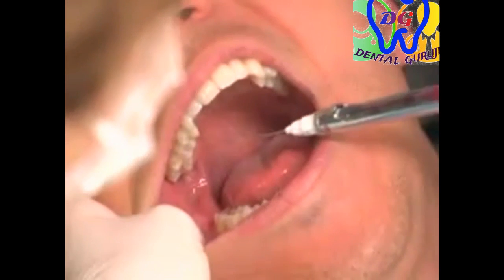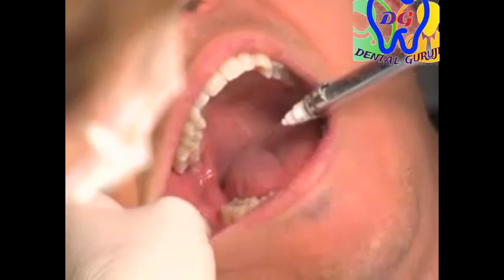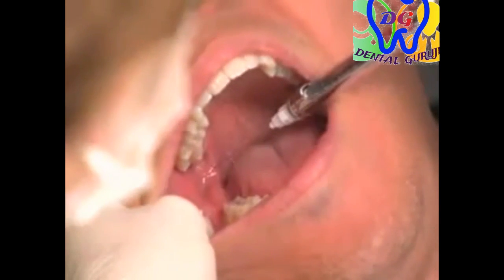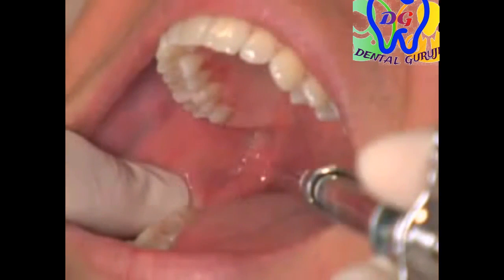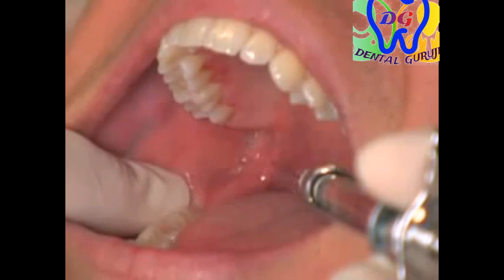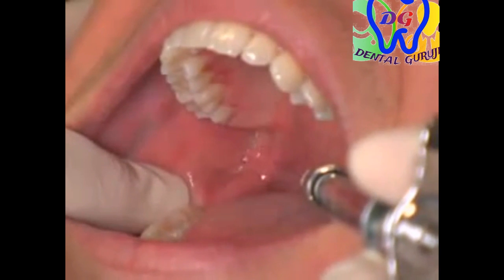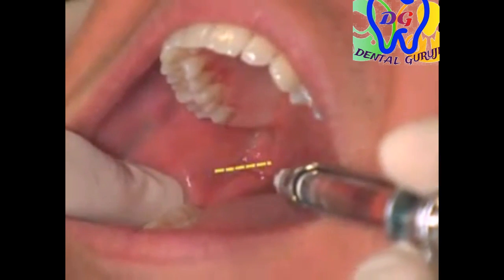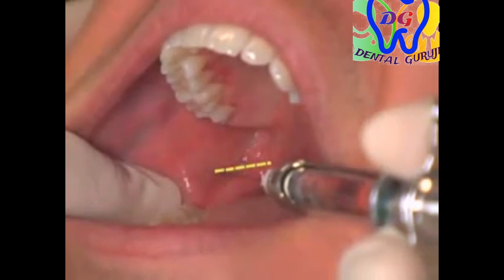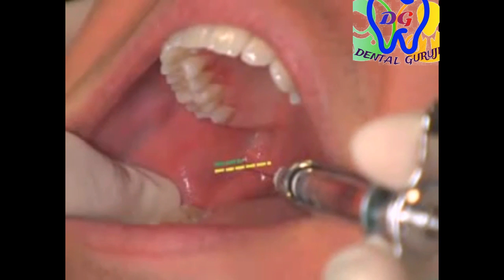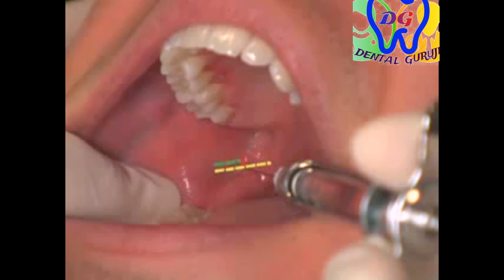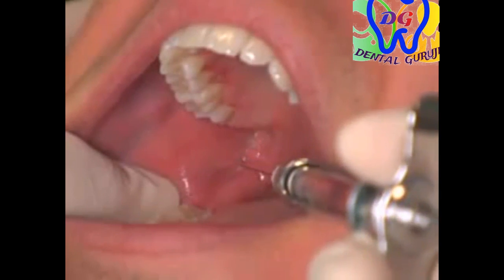The barrel of the syringe is placed in the corner of the mouth on the opposite side. The needle tip touches the most posterior aspect of the pterygomandibular raphe. The needle tip is then moved half the distance toward the coronoid notch and then half the distance back toward the raphe. This locates the injection site, which is three-quarters of the distance from the coronoid notch to the raphe.